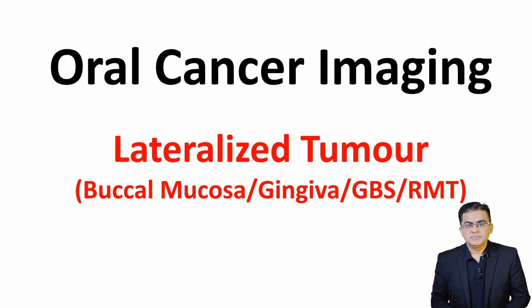Hello everyone. In our last video, we discussed imaging of oral cancer and looked at how MRI is an excellent imaging modality to evaluate tongue cancer. In this video, we are going to see how to image lateralized tumors of the oral cavity such as Buccal Mucosa, Gingiva, Gingivobuccal Sulcus and Retromolar Trigone.